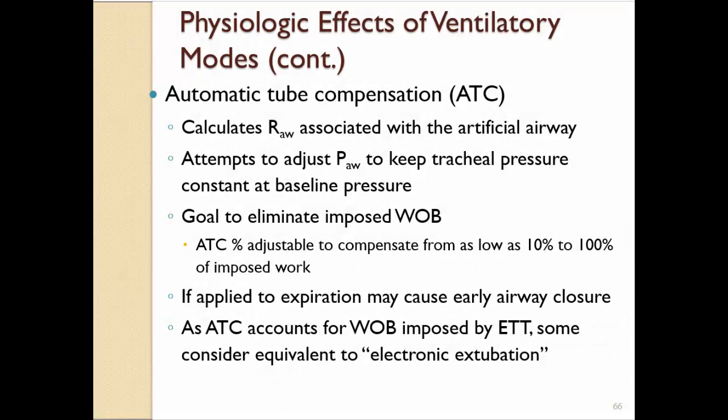Just a couple of thoughts about the ATC. Most of the time, we don't have to have an order to engage the ATC. However, when you have pressure support ventilation, if you have the patient that you're trying to wean, and you have the ATC engaged, and then you have pressure support ventilation, well, the idea of both of these modes is to overcome the resistance of the airway.